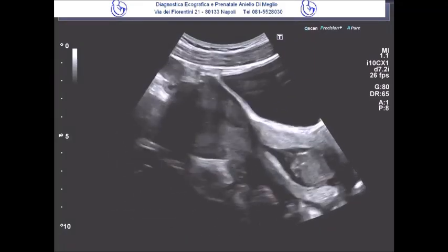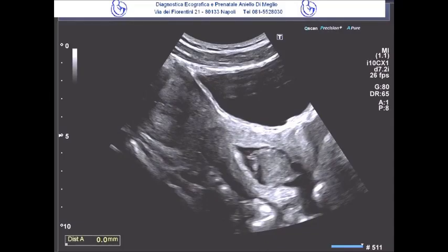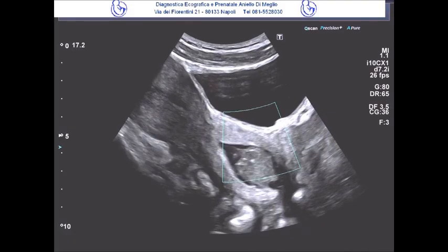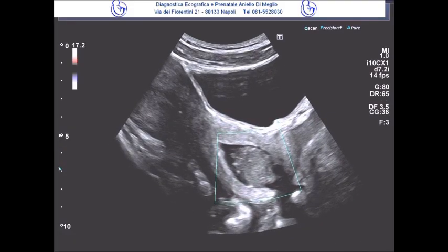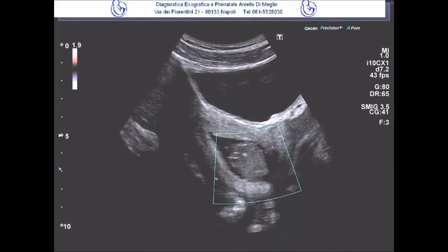Dear colleagues, in this video presentation we are going to present an interesting case of cervical formation resulting from a suspected myoma in expulsion. During the ultrasound examination, we will focus on the findings useful for making an ultrasound differential diagnosis between a myoma in expulsion and an endocervical polyp.